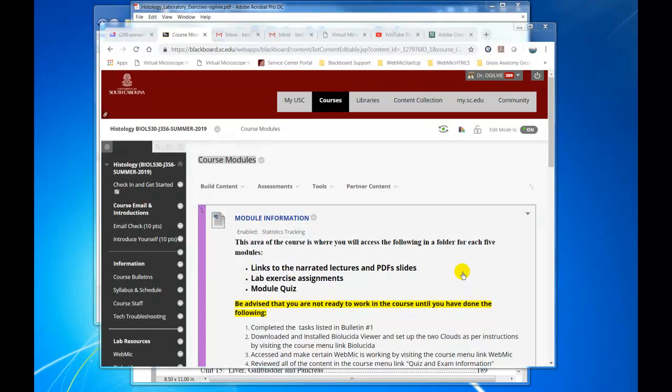This video will demonstrate the interaction between the course website and documents there and the Histology laboratory manual, which is a guide to the use and study of specimens in WebMic. The video will focus mostly on the epithelium lab to demonstrate how you use the lab manual with WebMic.